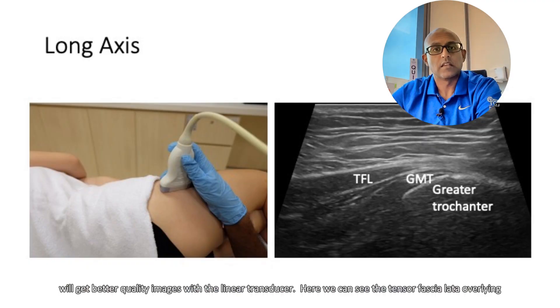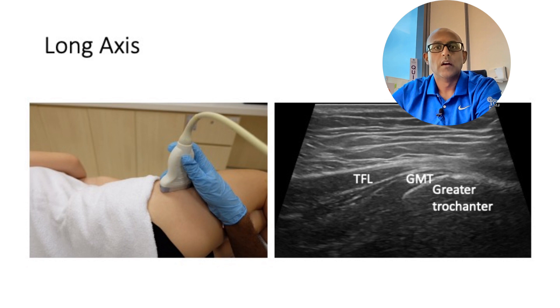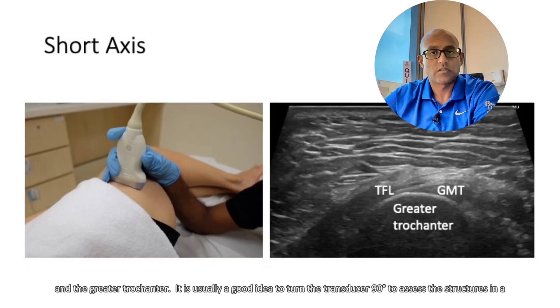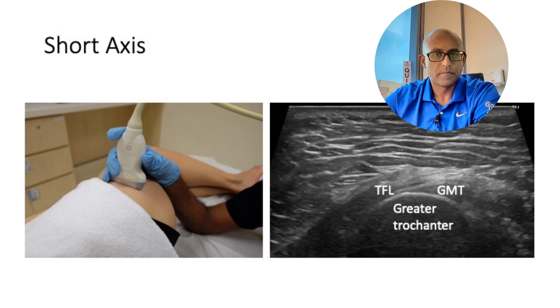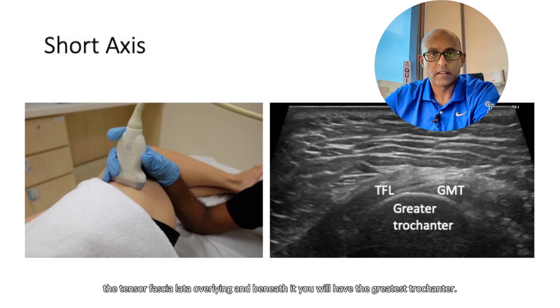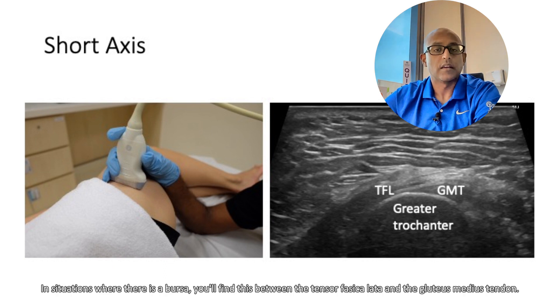Here we can see the tensor fasciae latae, the gluteus medius tendon, and the greater trochanter. It's usually a good idea to turn the transducer 90 degrees to assess the structures in a short axis orientation. Again, you will have the gluteus medius tendon, the tensor fasciae latae overlying, and beneath it the greater trochanter. In situations where there's a bursa, you will find this between the tensor fasciae latae and the gluteus medius tendon.